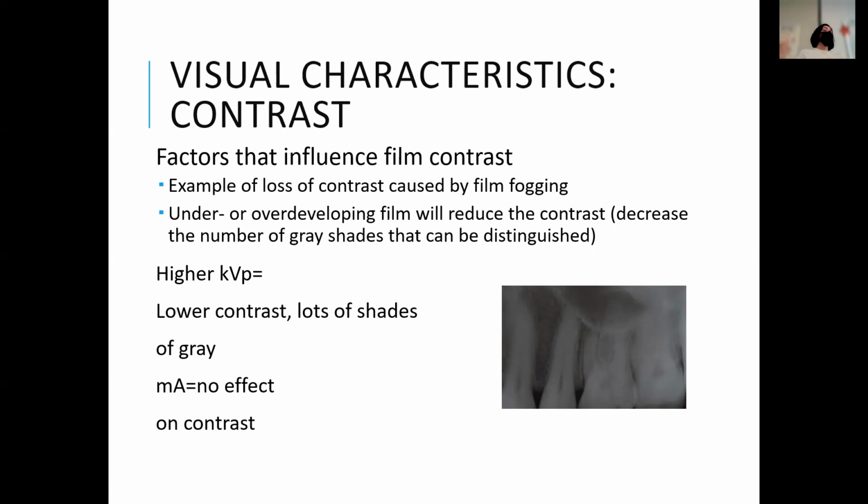What happens when we turn up the power? Does turning up the power increase our contrast or decrease our contrast? So lower contrast, lots of shades of gray, and you're going to have a visual.